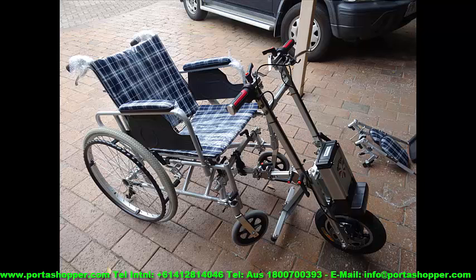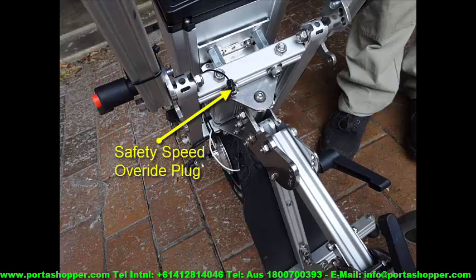If you study this picture properly, this is more or less the height that you should achieve on the front casters when hitched up. Here you can see the little black plug, which is the European Safety Standard speed governor, and this should only be unplugged once you are completely comfortable with taking the responsibility of engaging turbo speed, which would literally double the speed of your unit.